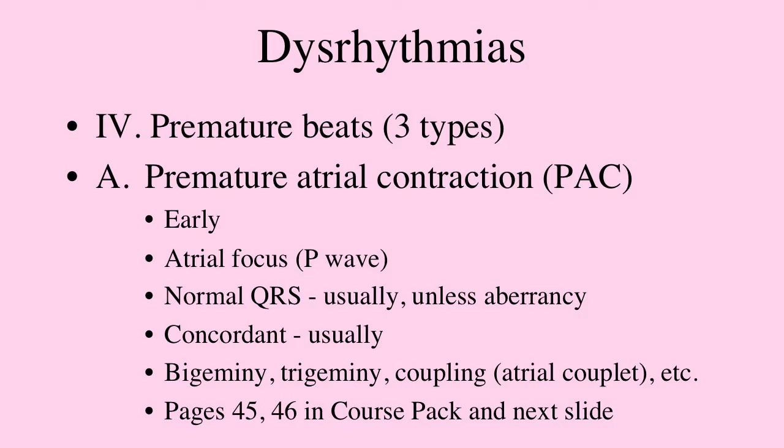If you look at the next slide, you have at the top a normal beat, normal beat, normal beat. The 4th beat over looks normal. The P wave looks upright. It's just that it's early, so it's a PAC. PACs are generally not a problem. The word clinically that we use is innocuous. Innocuous means harmless, usually harmless, unless you have a lot of them or they are triggering other problems. But usually a few PACs are generally not a problem.